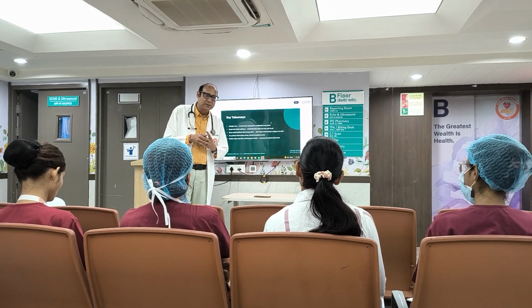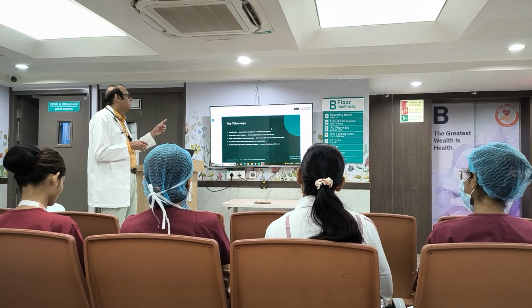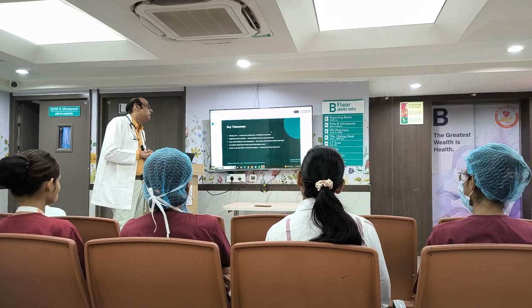Just keep in mind, because nobody told you before: oxygenation before acid base. Check PO2 and SpO2 before you even read the pH.